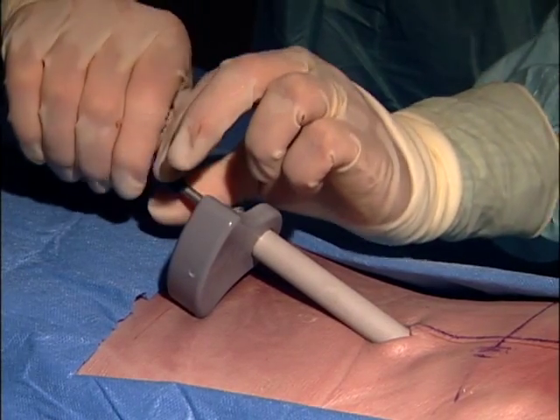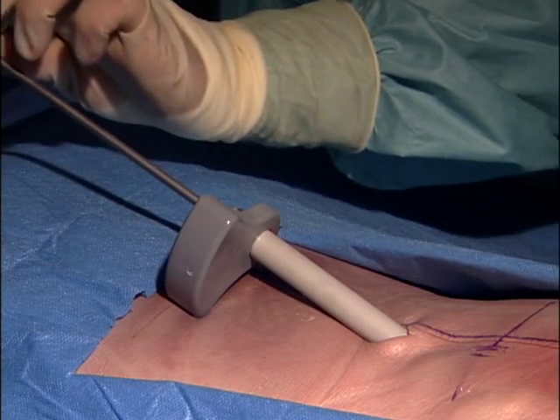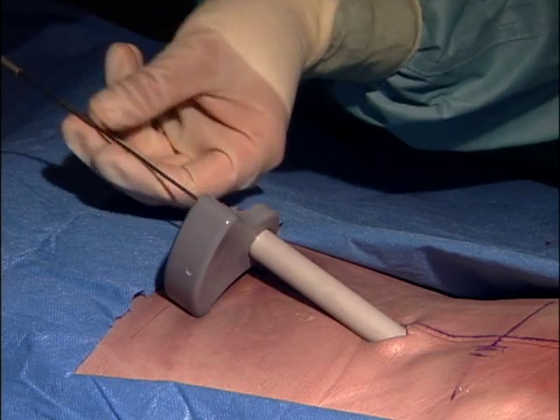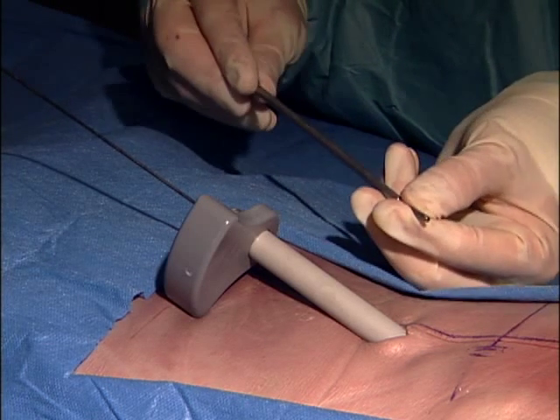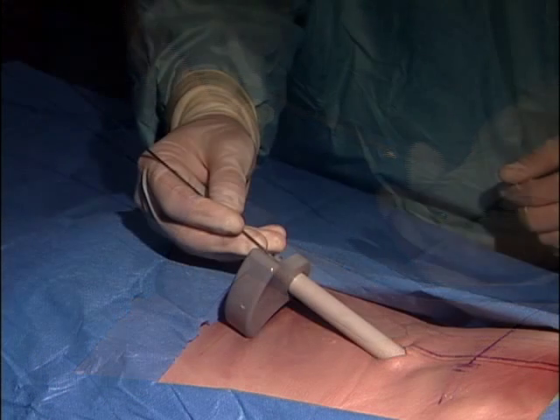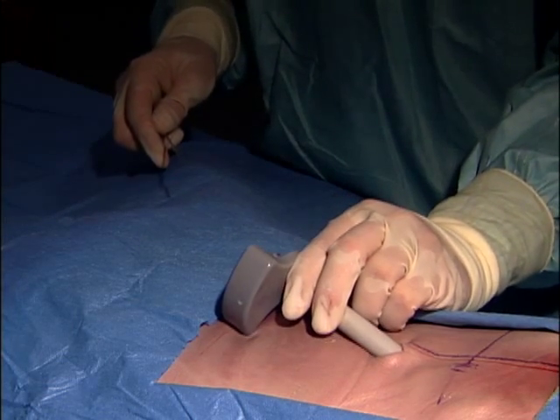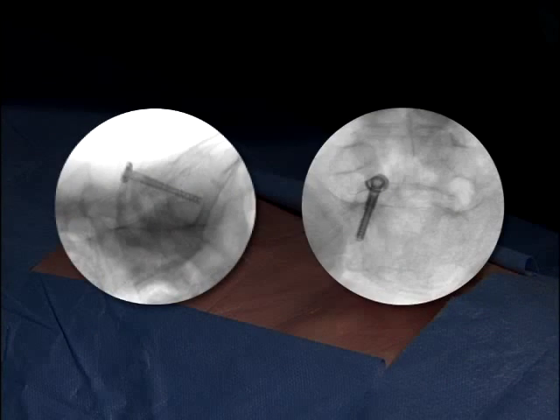Typically, it will take no more than 4 full turns for the threads to release, at which point the surgeon will hear and/or feel a clicking that will indicate that the pull pin has disengaged from the implant. At this point, the pull pin remover can be removed from the site, making sure to verify that the pull pin is still engaged with the pull pin remover. Final images are taken. The guide wire is removed, followed by the removal of the teleport tissue retractor. Final images of the bone lock implant in lateral and AP views.